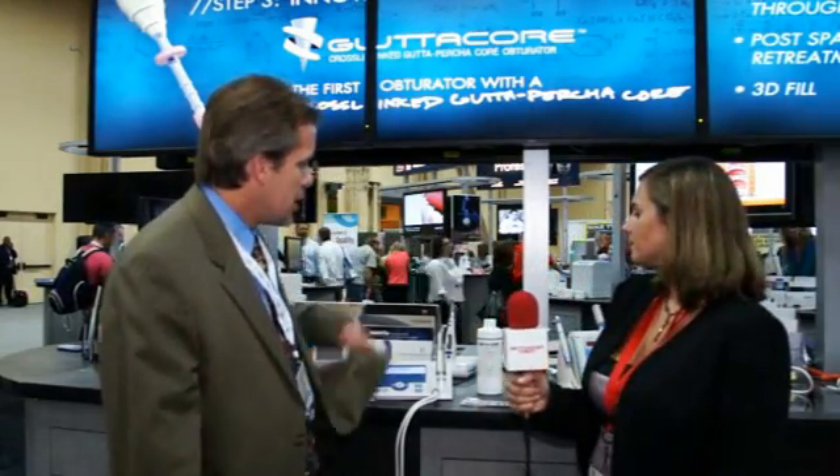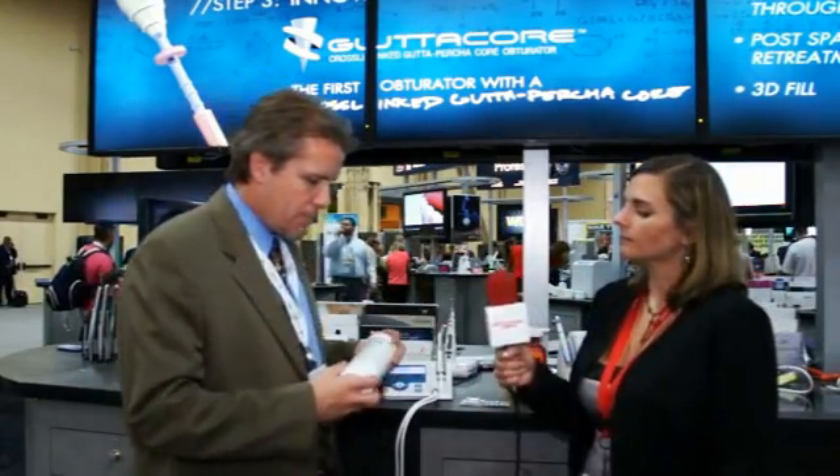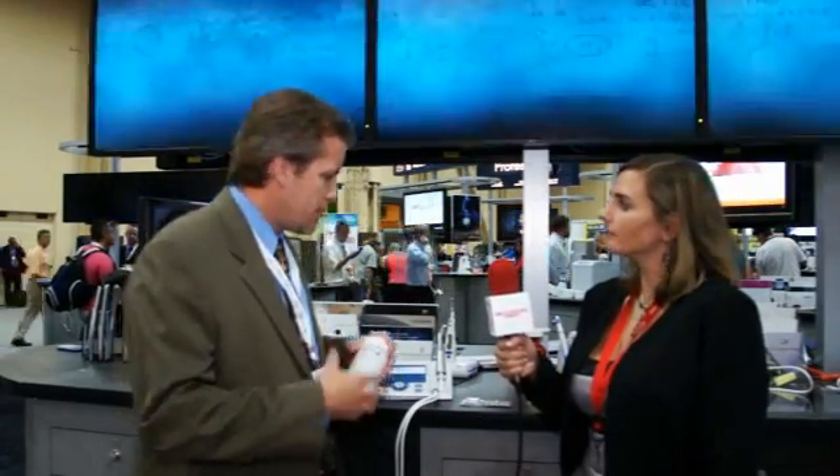What that does is put less stress on the file, and it helps the file wind its way down the canal. Can you tell us a little more about QMix? Absolutely.